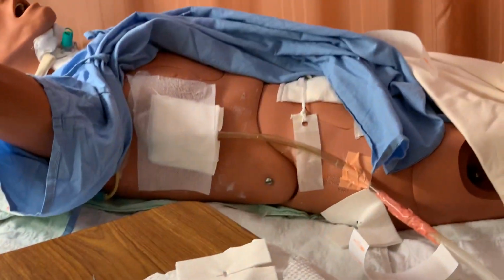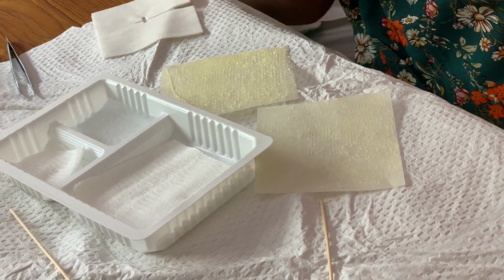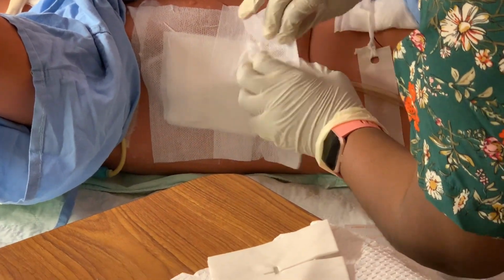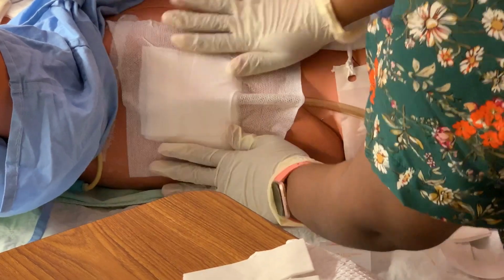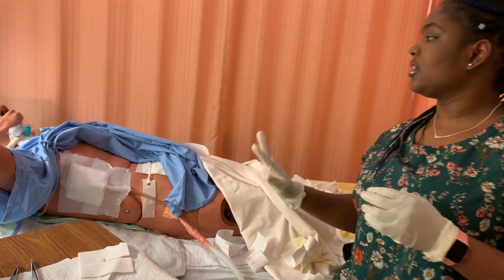And then I'll write my name and the date on this part of the dressing, so the other nurse knows when I changed the dressing. Tape on this to make sure it's fully occlusive. So now I've done the dressing. Patient tolerated the procedure very well, and I'm gonna put him back in his position, and that's it.